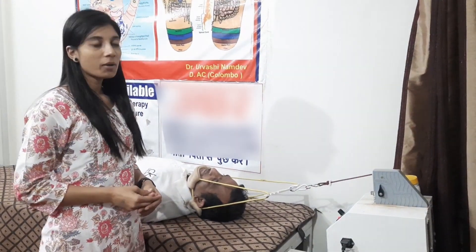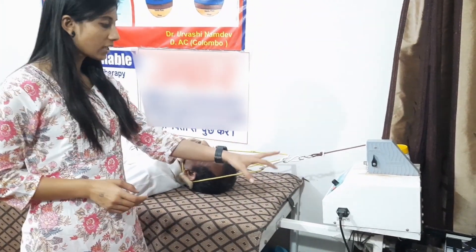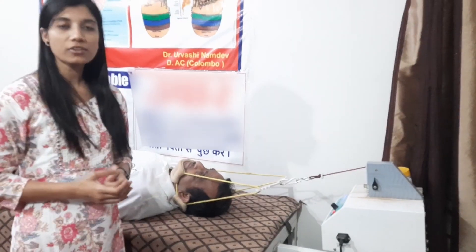Today we are going to talk about cervical traction.